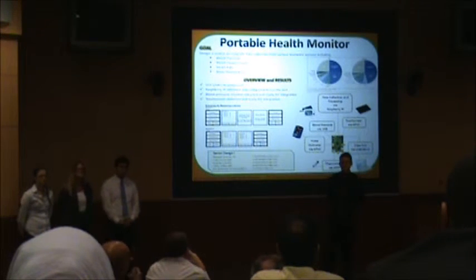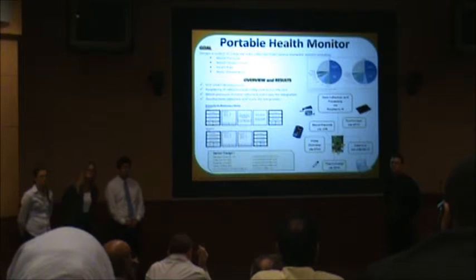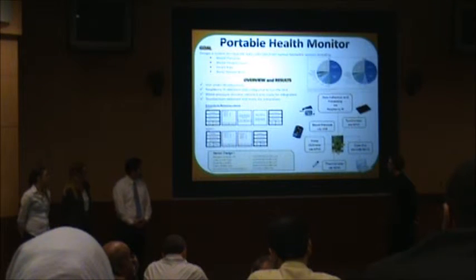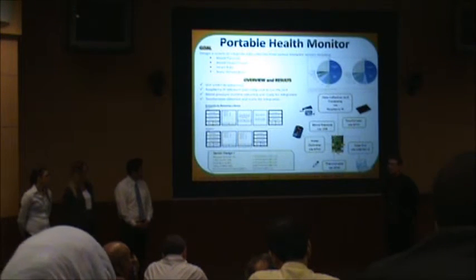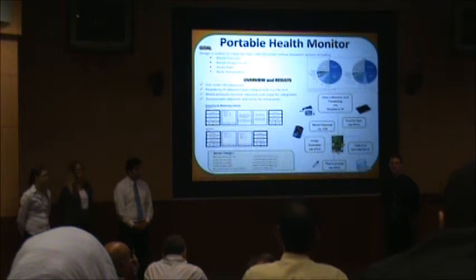So why did you choose to use a USB connection instead of wireless connection? I guess a lot of these devices have wireless connections, and the Raspberry Pi has all wireless on there, right? It has Wi-Fi, and you can actually go Bluetooth through a USB dongle. Main reason is because we're just learning how to interface the software and the hardware, and we know certain things about the USB interface on the blood pressure monitor, so it's just helping us in our baby steps there.